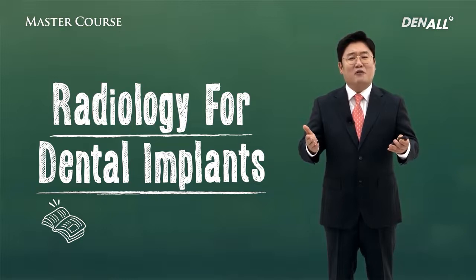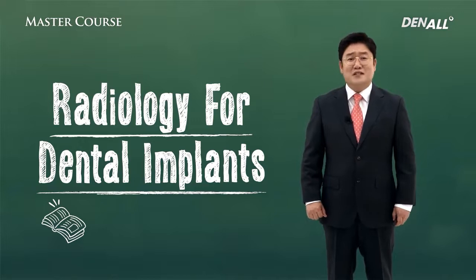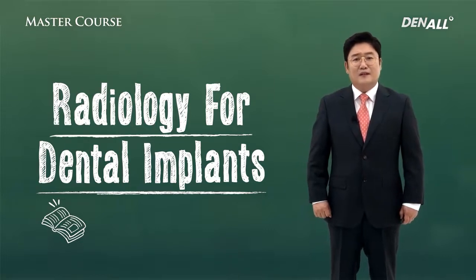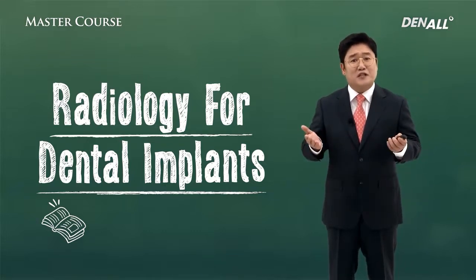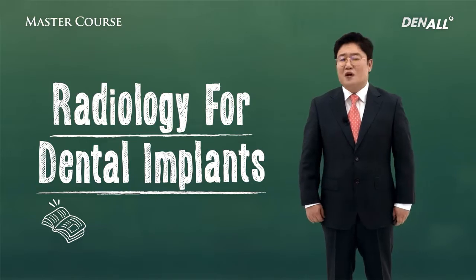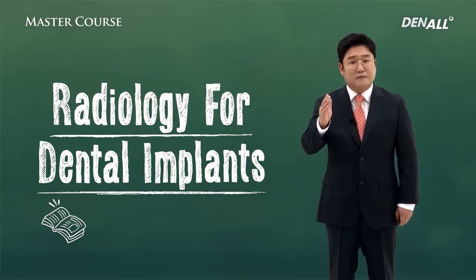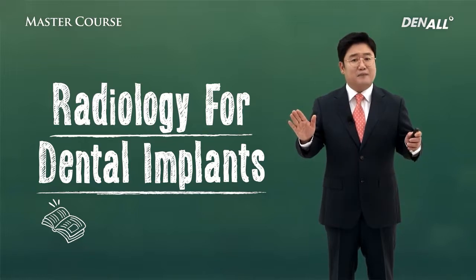Today, so many things change so rapidly. Every day, we are bombarded by new stuff. So if you talk about the basic things, you may be regarded as an outdated person. Radiology is a case in point in dentistry. It is performed as a daily routine, so relatively, it is considered as trivial, not very important. But when it comes to studying implantology, we need to record, diagnose, and interpret each and every individual patient's situation, so its importance cannot be overemphasized.